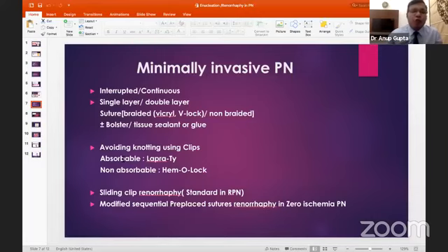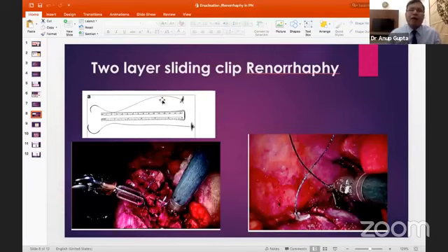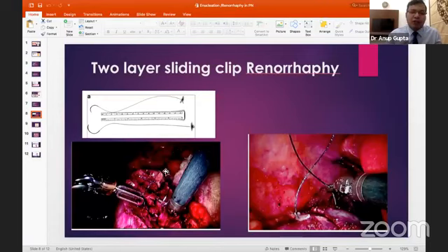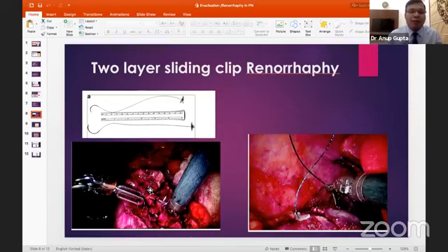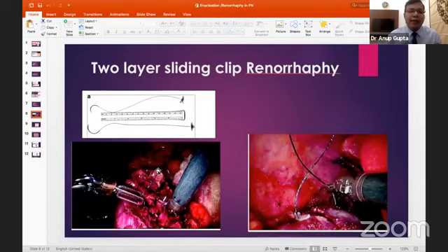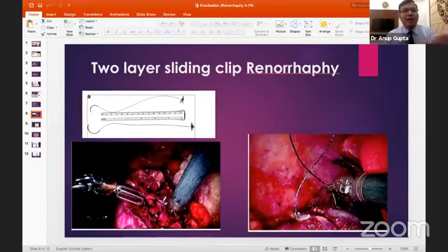My favorite technique is the two-layer sliding clip renorrhaphy using a 3-0 V-lock suture on a V20 needle. I start with the inner layer, taking the pelvicalyceal system along with small bleeders without separately closing the PCS, then apply a Hem-o-lok. The second layer uses a 2-0 V-lock suture on a GS21 needle with a sliding clip on the other side to achieve good hemostasis.